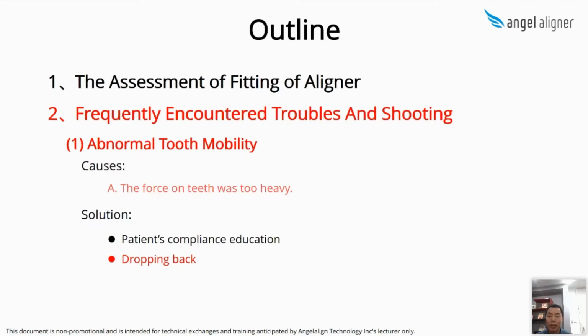If the tooth mobility is larger than 2 degrees, back up to the current aligner. In this kind of situation, monitor the patient closely until the treatment is back on track again. If you cannot get an aligner that best fits the arrangement of the teeth intraorally, you may submit a reboot, and we can design a new ISO treatment plan.